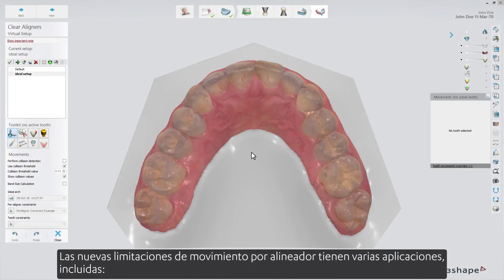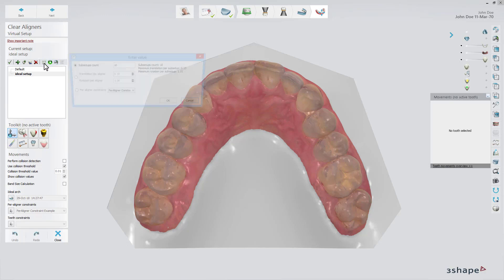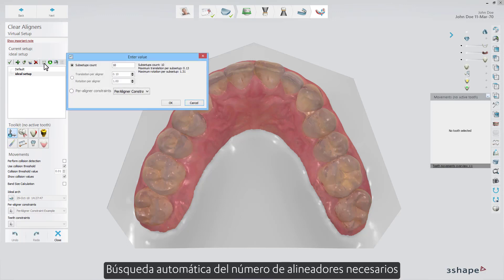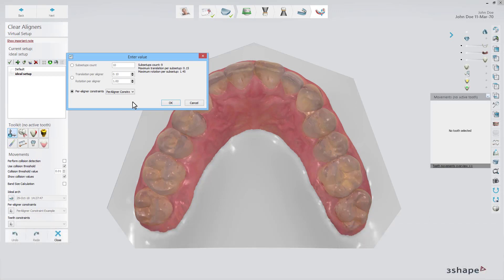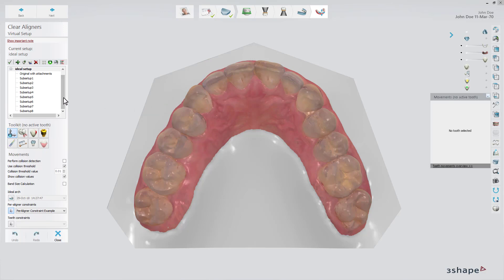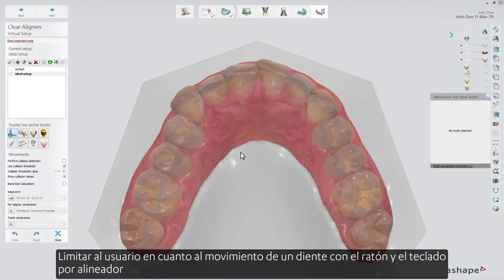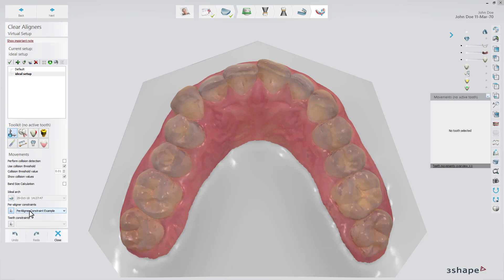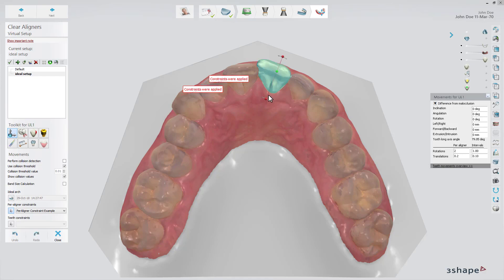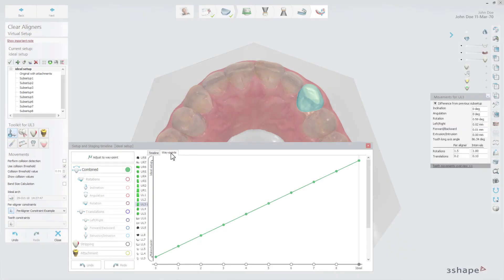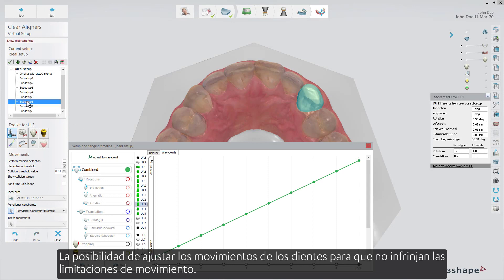The new per aligner movement constraints have several applications, including: automatically finding the number of aligners needed; limiting the user on how much a tooth is moved using the mouse and keyboard per aligner; and the possibility to adjust teeth movements so they don't violate the movement constraints.